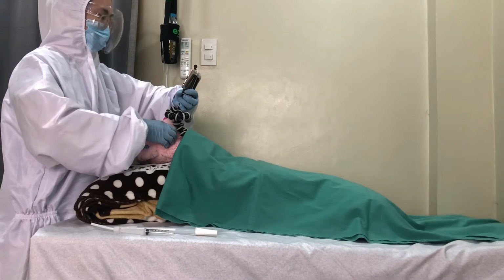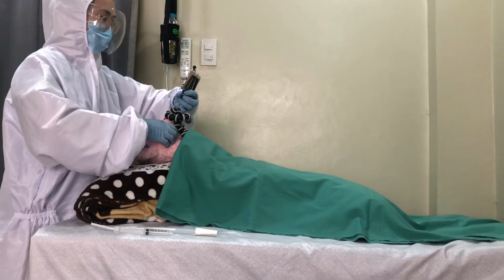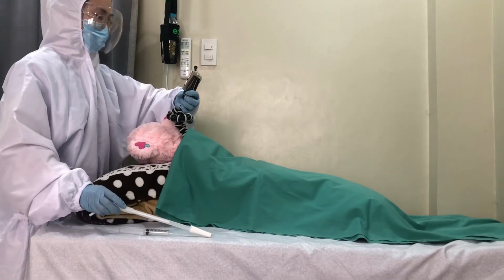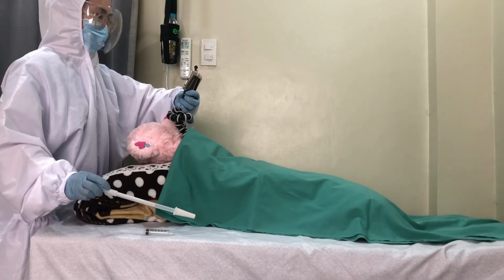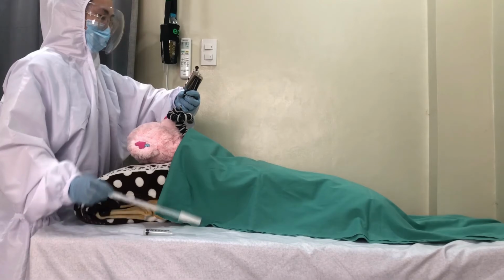Advance the tip of the laryngoscope blade into the vallecula between the epiglottis and the tongue. With the handle of the laryngoscope pointing away from you at 45 degrees, lift upwards and away to lift up the tongue and the epiglottis to display the vocal cords and the laryngeal opening.